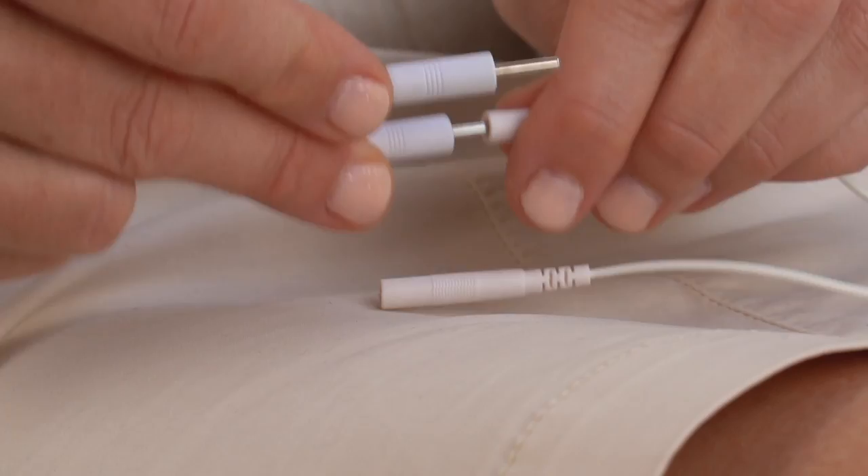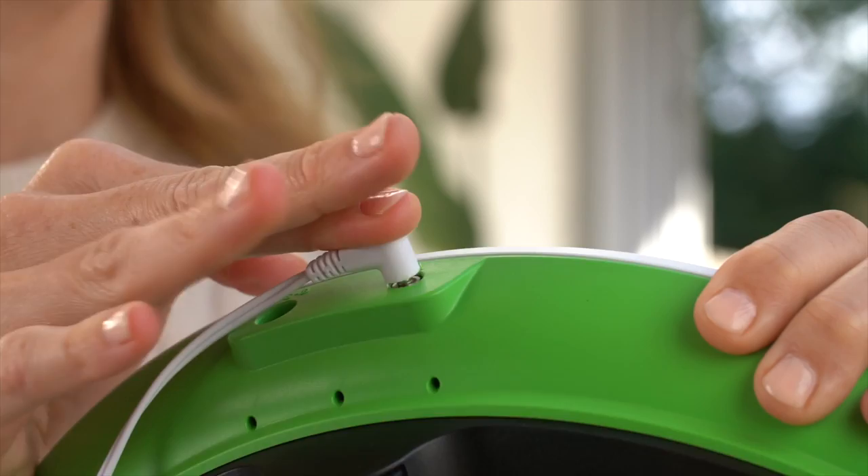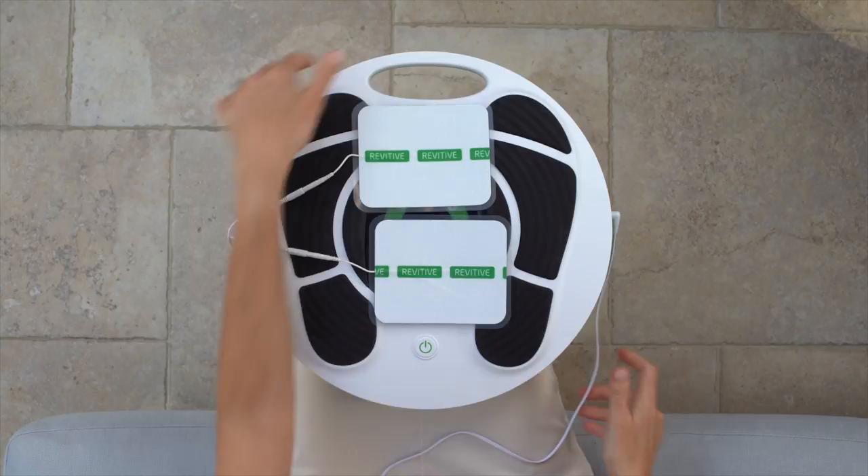First, attach the ends of the thigh pads to the electrode cord. Then, plug the other end of the electrode cord into the socket on the side of Revitiv. Be aware you won't be able to use the foot pads while the electrode cord is plugged in.